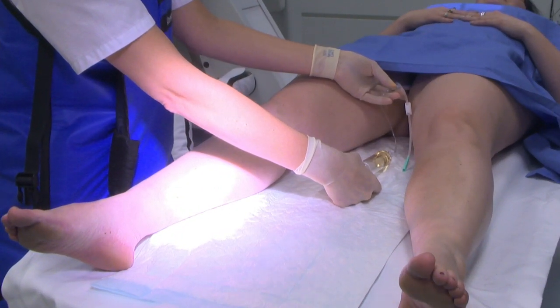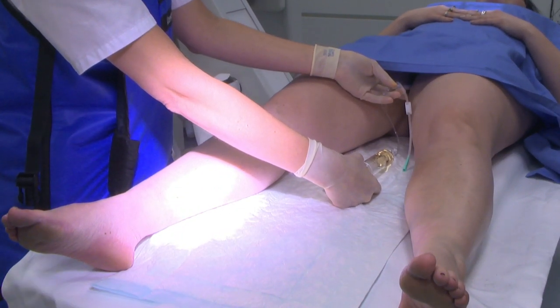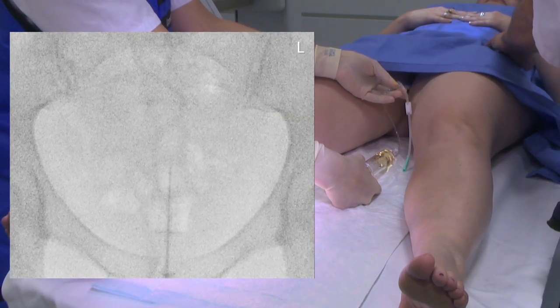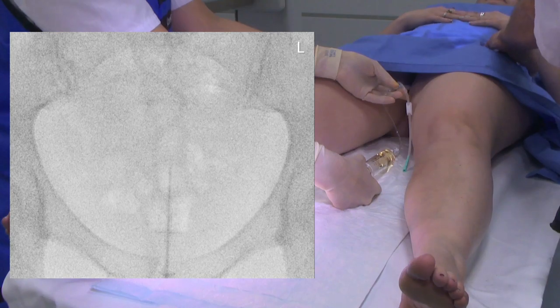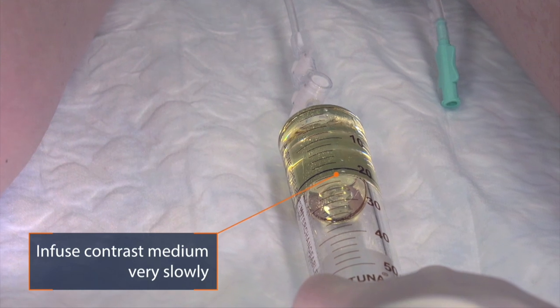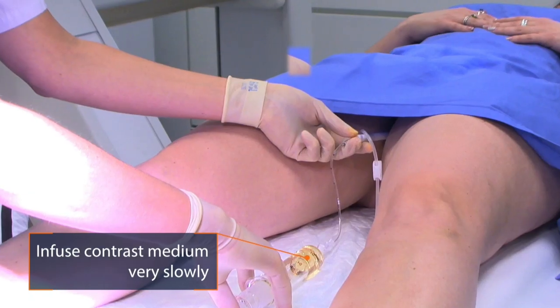First we will start with a plain picture so we can compare the other pictures with the first plain one. Now I will start with a slow infusion of the contrast media — very slow, because then it will be less painful for the patient.